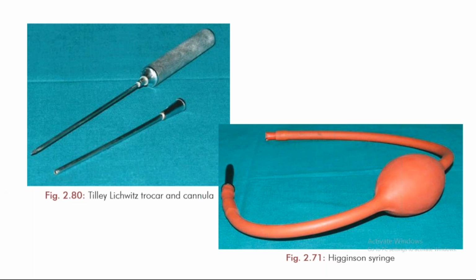Once the saline goes into the maxillary sinus, whatever mucosal plug is obstructing the maxillary ostium is forced out into the nasal cavity. Whenever you are pressing the bulb, ask the patient to hold his or her breath, and then flush. Continue to flush until the returning fluid is completely clear.